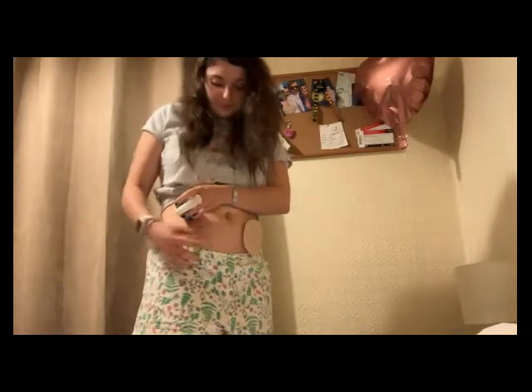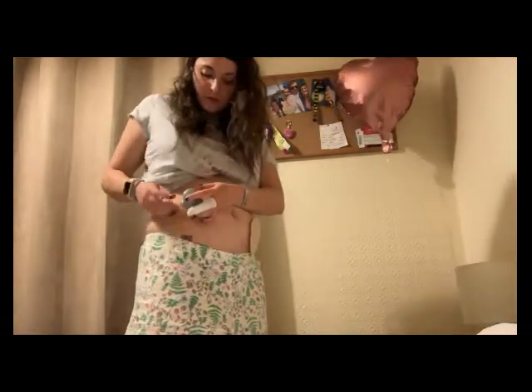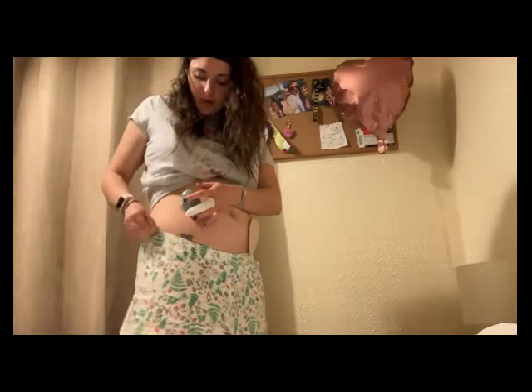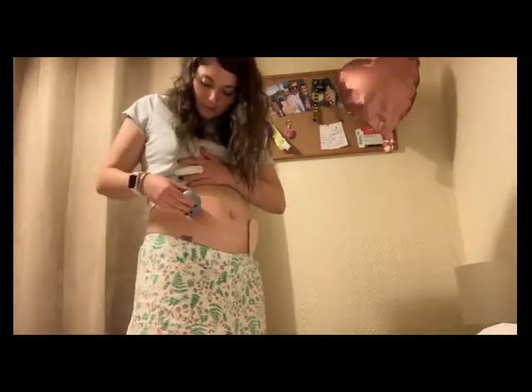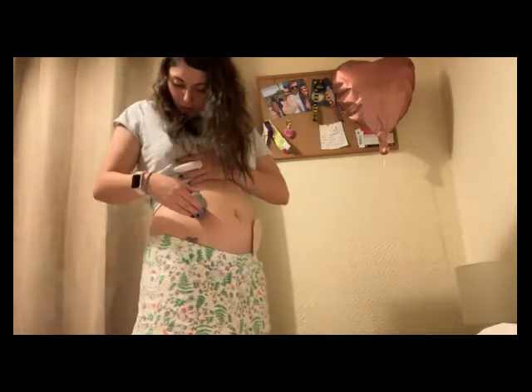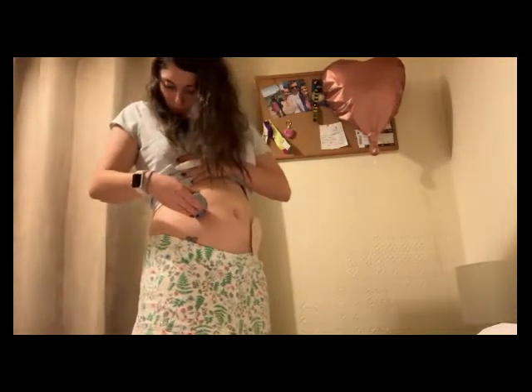But yeah, put it there, and then when that sensor's in, because I like to pull my trousers up a little bit so it's there-ish, so my bag doesn't keep getting in my way. My trousers are covering it a bit. So when my trouser band's up there, I can clip my thing to it.